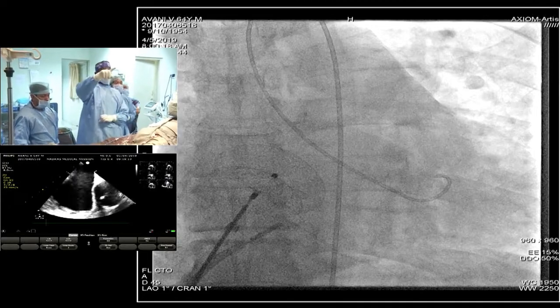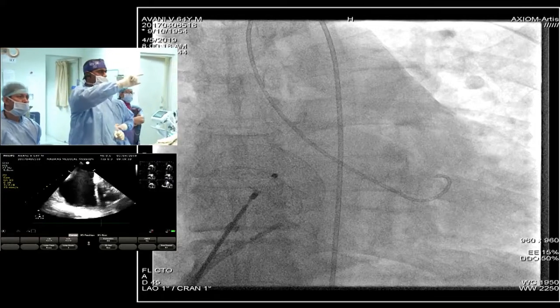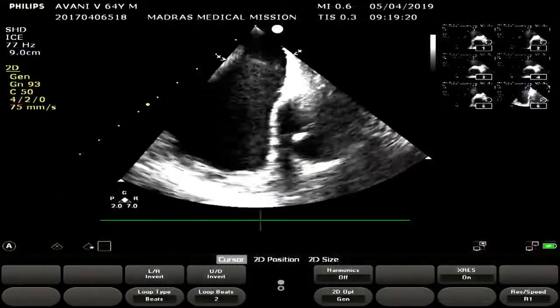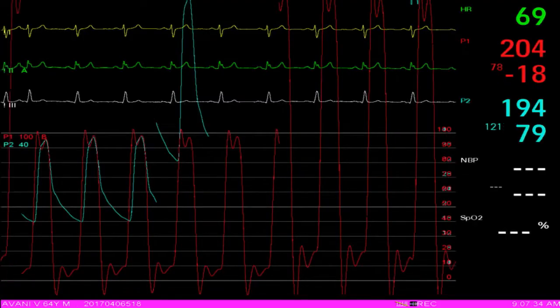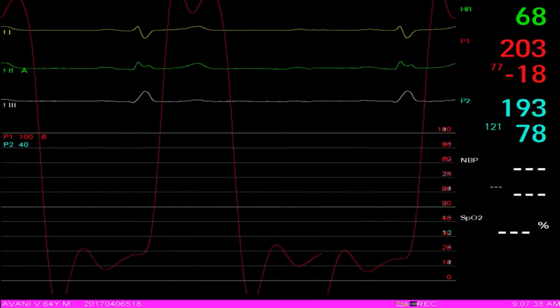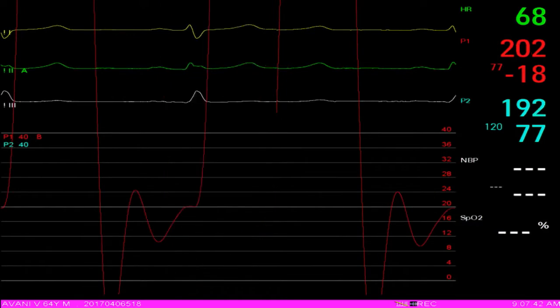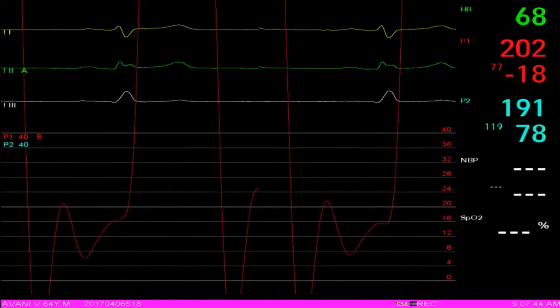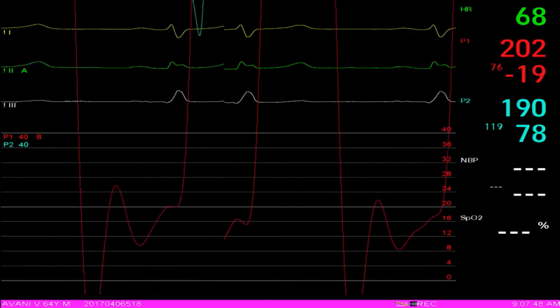But yeah, can you show the hemodynamics live now? Take away our pictures. Show the hemodynamics live. Yeah, so this is the left ventricular end diastolic pressure. It's somewhere around 16. Make it in 20 scales. So when do you decide to pull off the device? What pressure measurements would it be?